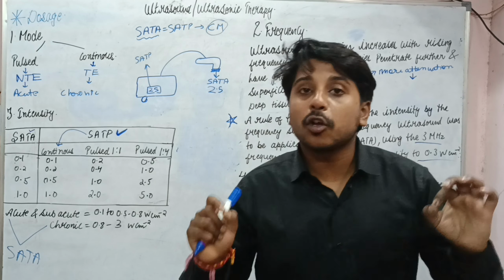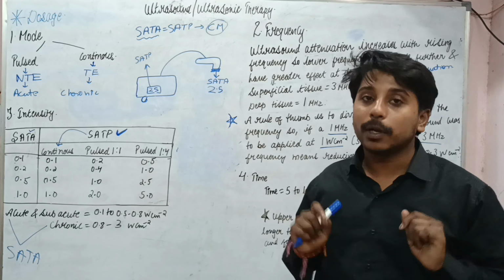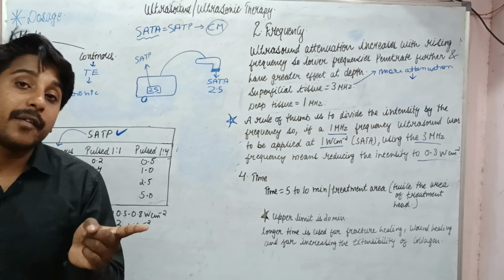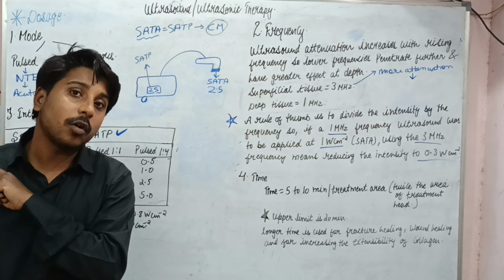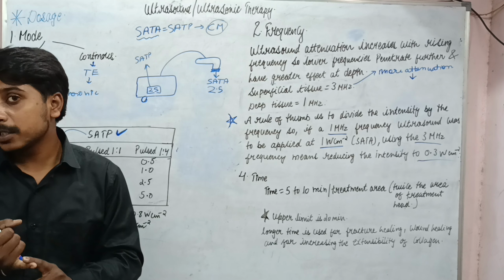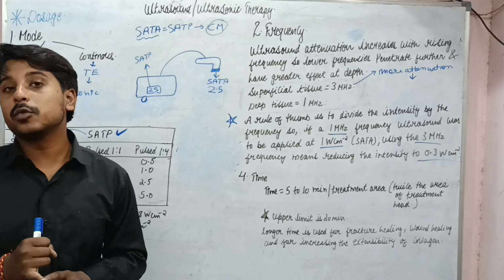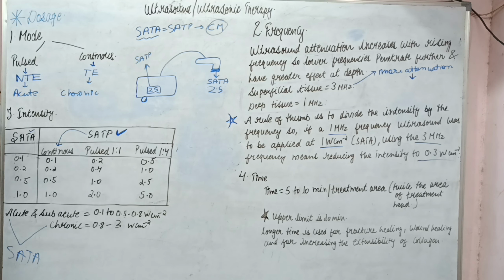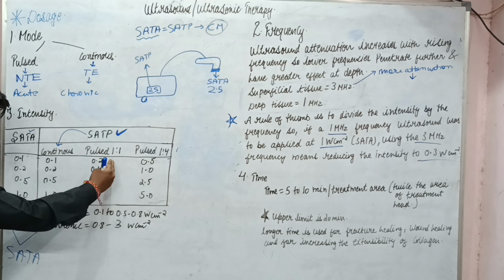But in case of pulsed mode, where we have mark space ratio, duty cycle, and I have explained to you the effect of pulsing also. So you must have the complete knowledge of these two things: pulse mode, continuous mode, and effect of pulsing. Now, what you can see from this graph, initially you were just watching this part, now watch this part.